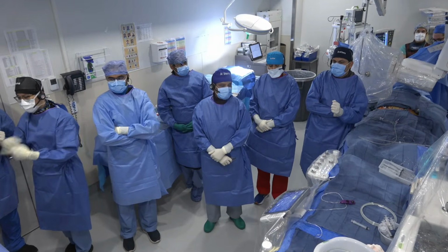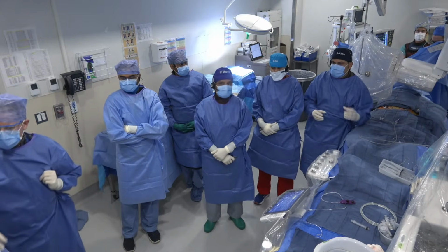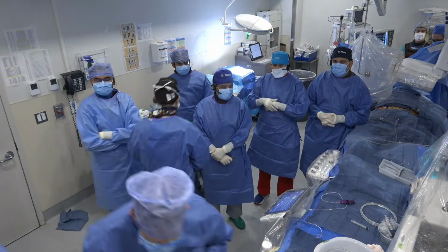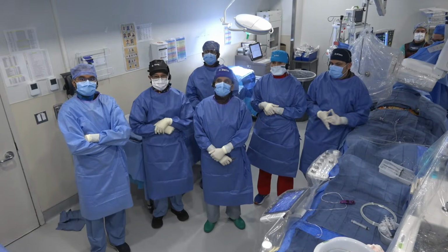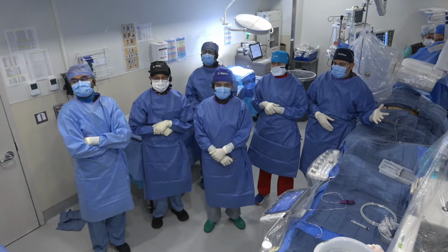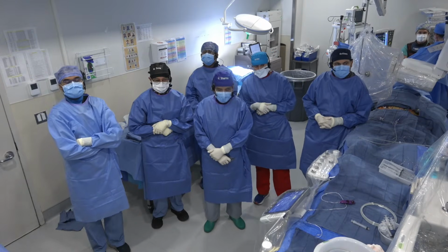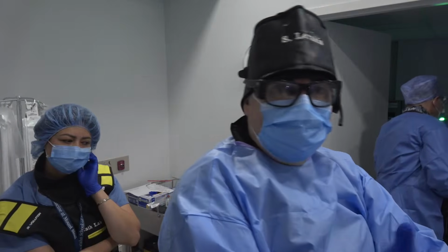Trying to plug CoreValves is very hard, because unless you have very generous sinuses, trying to plug CoreValves is extremely hard. So most of these patients may have more than mild PVL, and we are probably underestimating PVLs at this point. Because we do TTE only procedures, not TEE, it just makes quantification very hard.